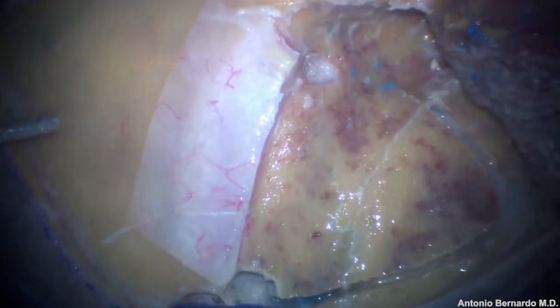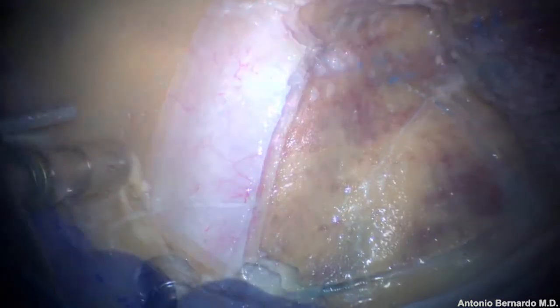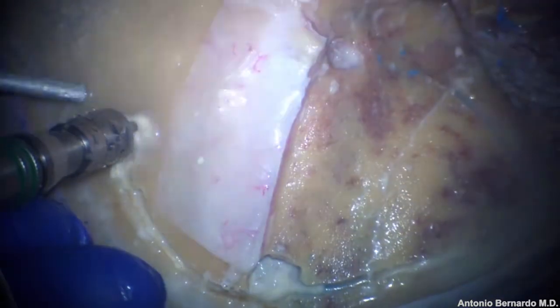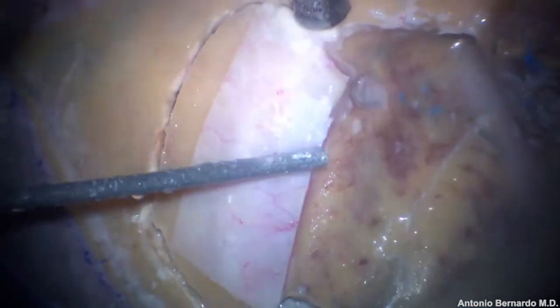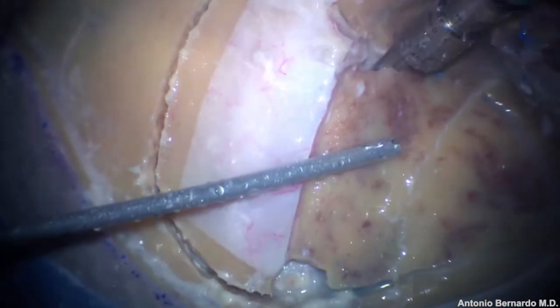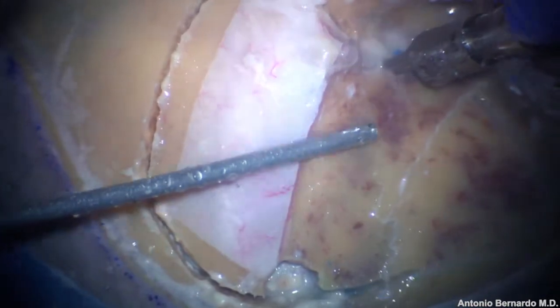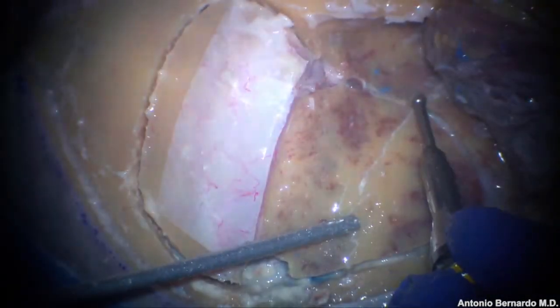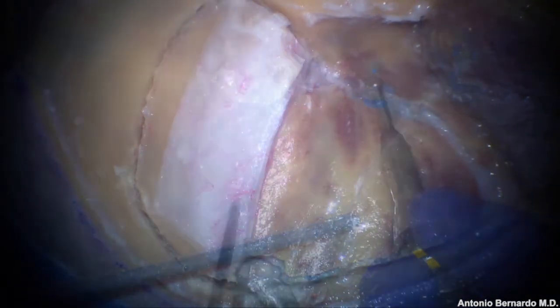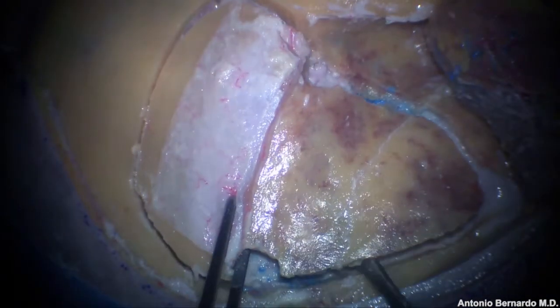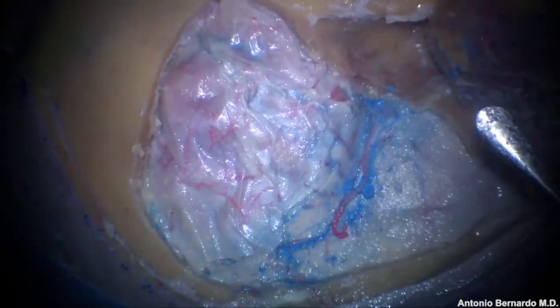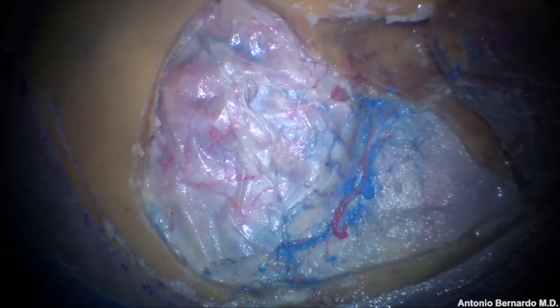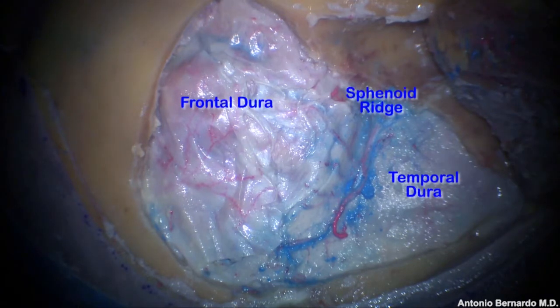Using an osteotome, a periosteal cut is made; a cut is used across the sphenoid ridge, and the bone flap is finally elevated, exposing the frontal dura and the temporal dura.